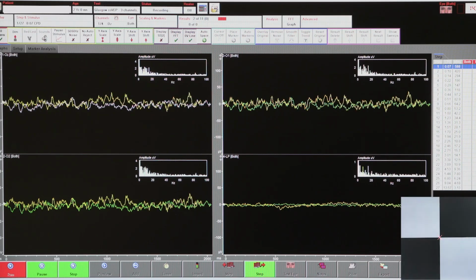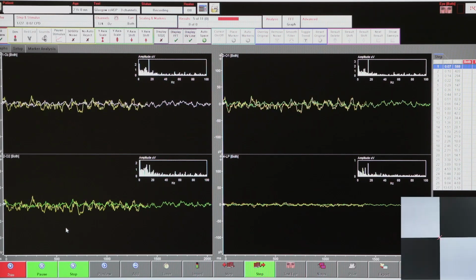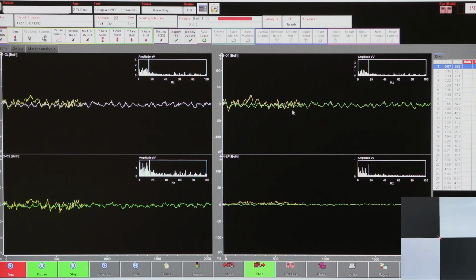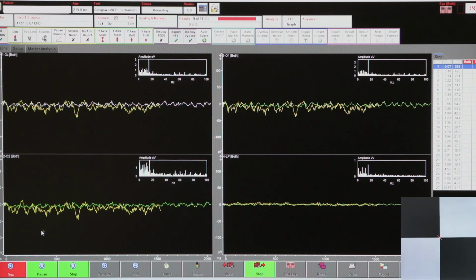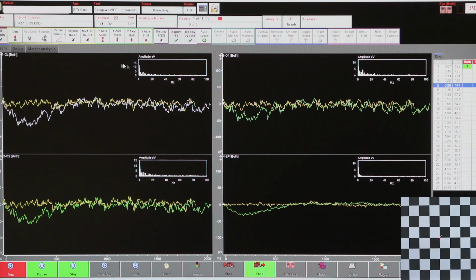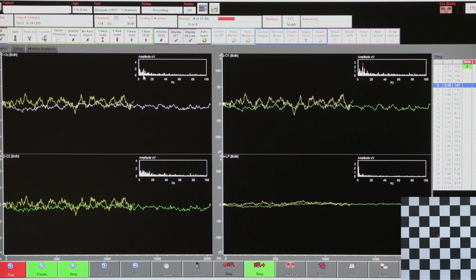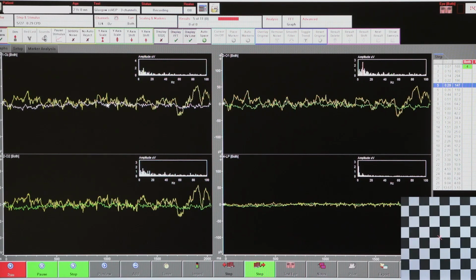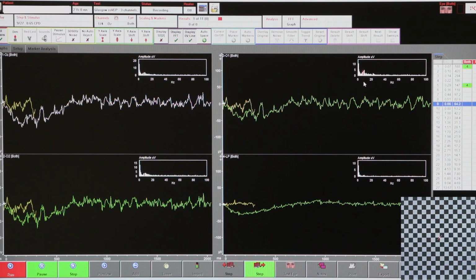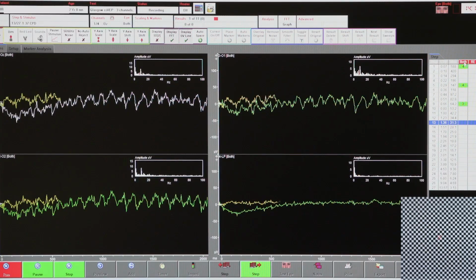So let's start our recording now. You can see the 4 channels of ongoing EEG data. And inset in each of these time-based windows is a frequency-based plot. We're looking for a significant VEP at the stimulation frequency. A VEP was found there, and you can see that the stimulus has changed to a smaller check size. And in the results table, we have a green detection against that last check size, and we've dropped 4 steps, and we're now trying the check sizes indicated by the blue band. If the VEP is quite big and fixation is good, the VEP can be detected in 1 or 2 seconds, so it can be pretty quick.